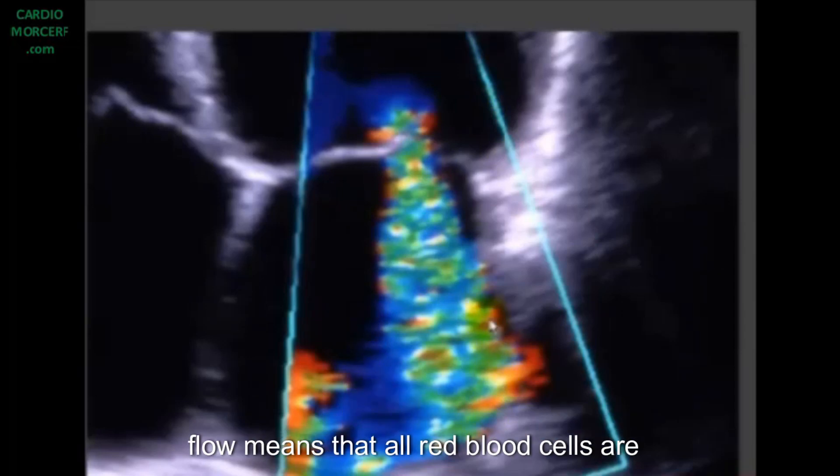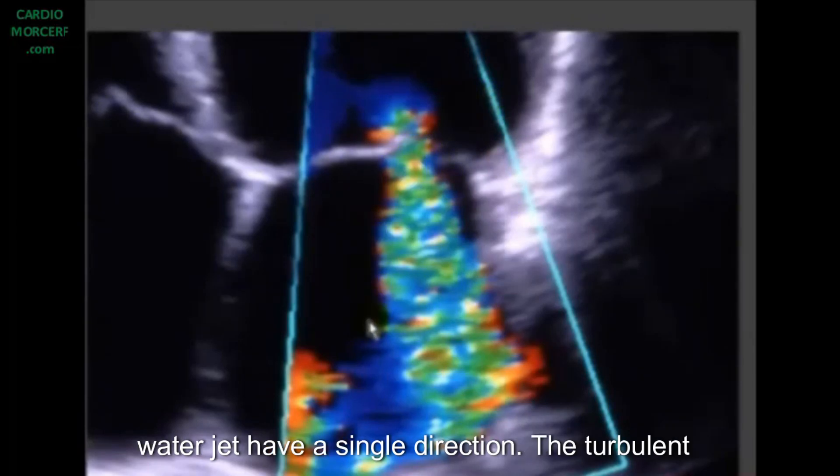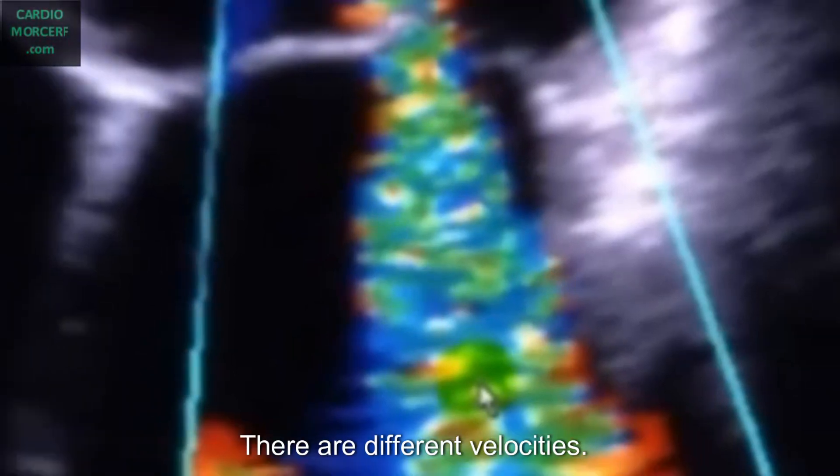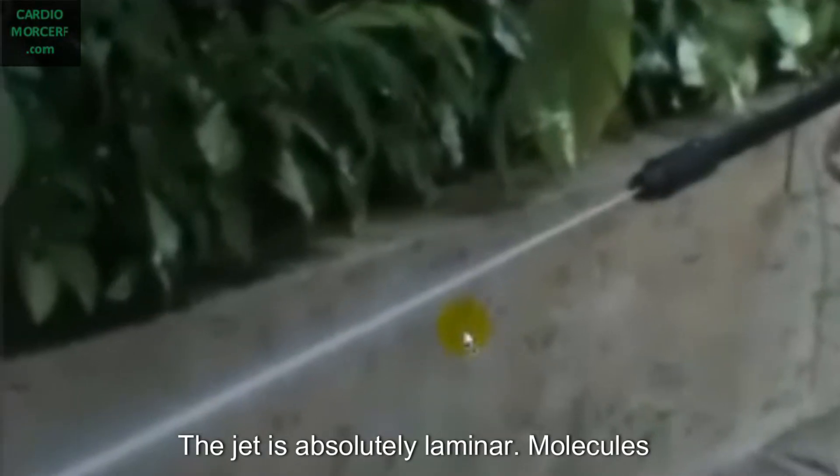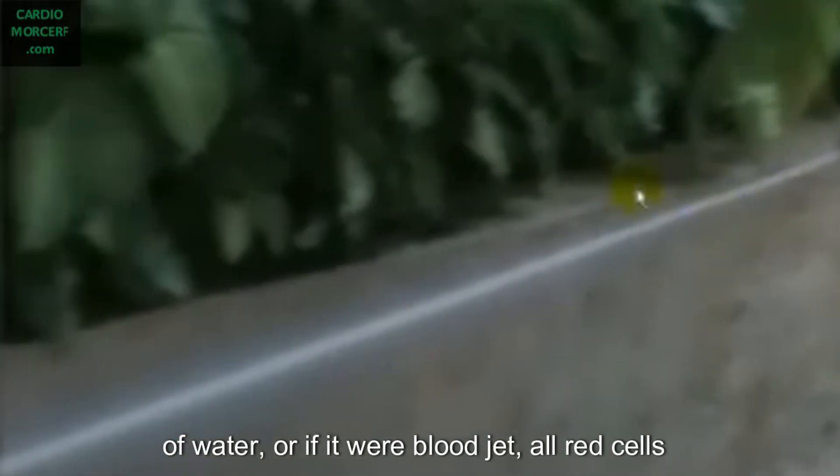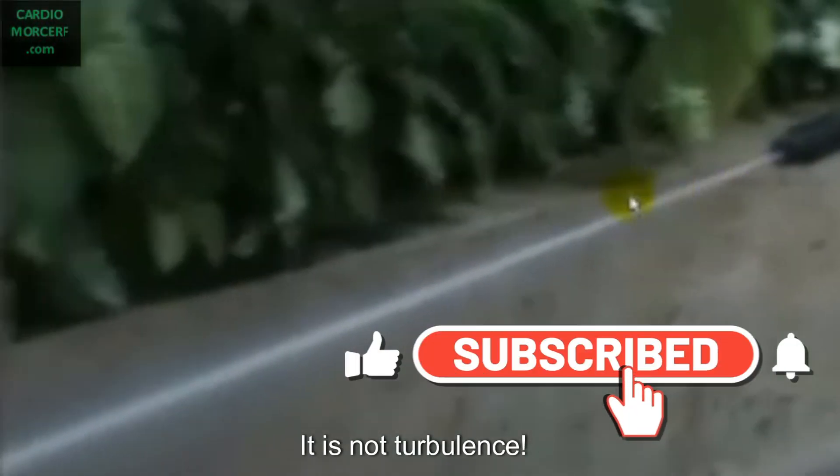A laminar flow means that all red blood cells are moving in one single direction. Just like in the jet of water, for sure, all molecules of water have a single direction. A turbulent flow would have molecules of water going in all directions, including contrary to the flow, with different velocities. The jet is absolutely laminar. All molecules of water, or if it were blood, all red cells would be moving in a single direction. It is not turbulent.